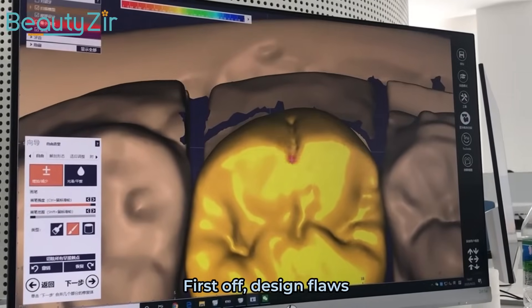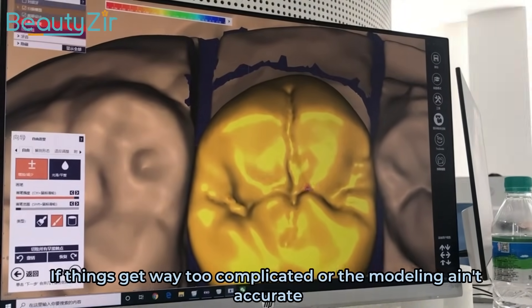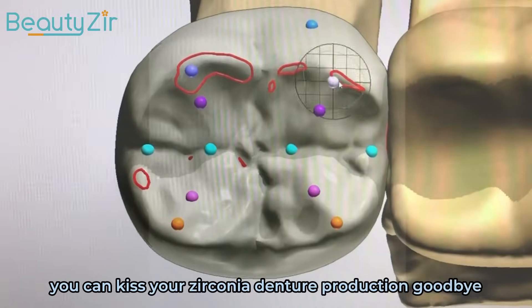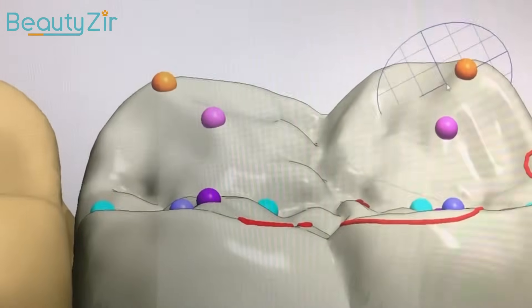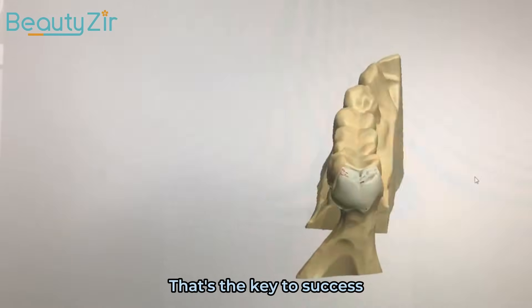First off, design flaws. If things get way too complicated or the modeling is inaccurate, you can kiss your zirconia dentures production goodbye. You gotta have the proper design and accurate modeling — that's the key to success.